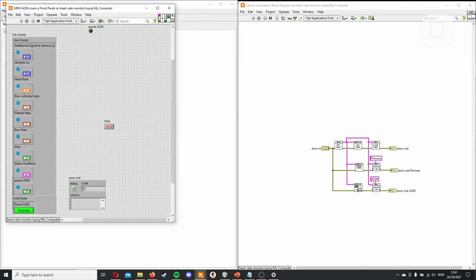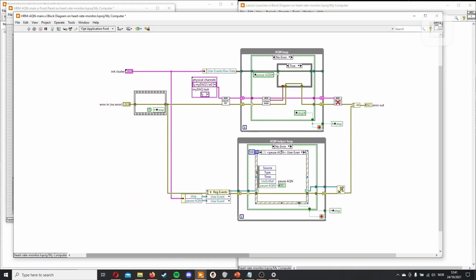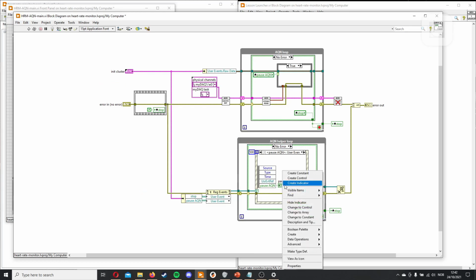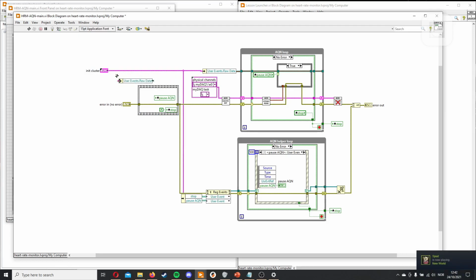And we need to add the same to the acquisition. Here we already have some sort of similar thing, so we can just expand upon that. We will need to set this one. If you copy a local variable, you will get a new button and a copy. So that doesn't work. You could always just create a local variable from here and this will work. But alternatively, you could just copy this by holding Control and dragging it, and you will be part of the same local variable. And we want to access here, so we'll just copy this unbundle by name. And what we want is the pause acquisition. And now they start from the same state.